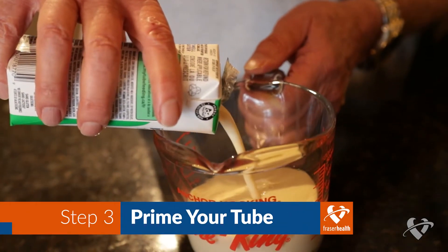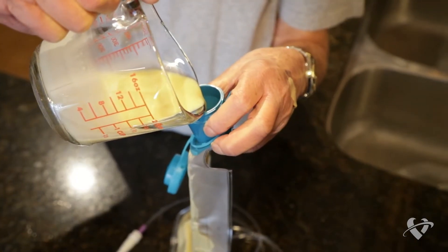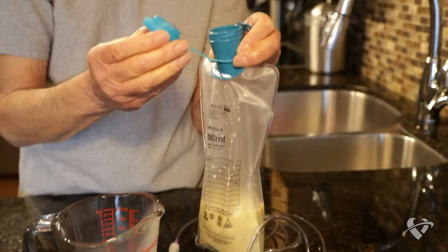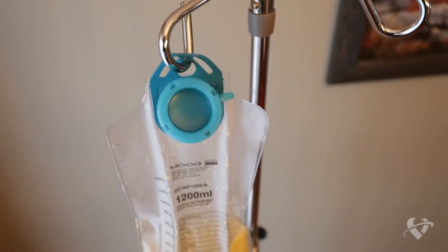Measure the recommended amount of formula into the measuring cup. Ensure the roller clamp is closed. Pour the formula into the feeding bag and remove the air by gently squeezing the top before you replace the cap. Hang it on your IV pole.